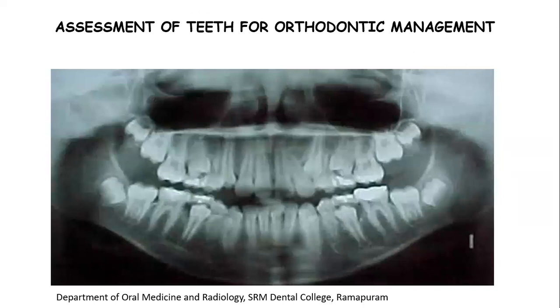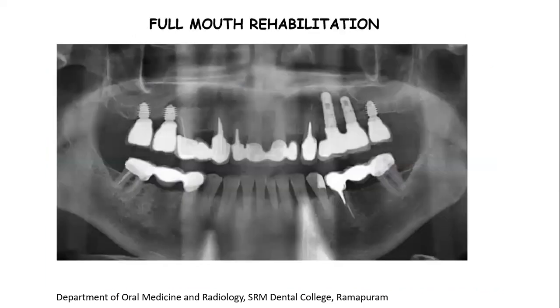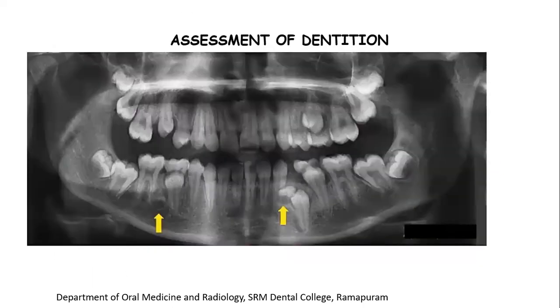It is also used for assessment of teeth for orthodontic movement, for orthodontic management, supplemented with a lateral cephalogram. In cases of prosthodontics, for evaluating for full mouth rehabilitation, for assessment of dentition. In pediatrics, to show the eruption stage, it can be used for age estimation of the teeth. Here, there's a case of mixed dentition where both the primary and the permanent teeth are seen.